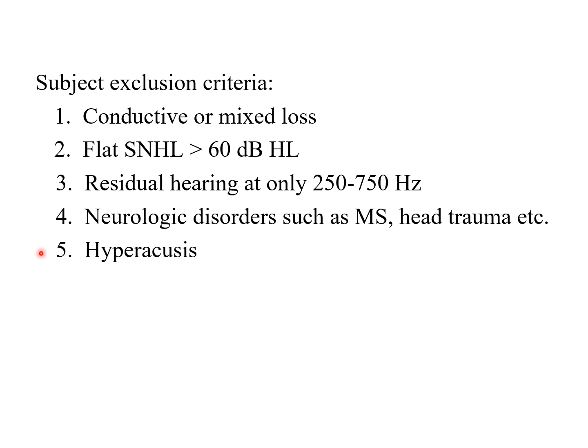So when the sound becomes louder, we should recruit more neurons. That's normal. But some patients recruit too many neurons. So the increment of recruitment for neurons is way too much compared to the increment in the stimulation. So for these kinds of patients, stacked ABRs do not work on them, so we need to exclude them.